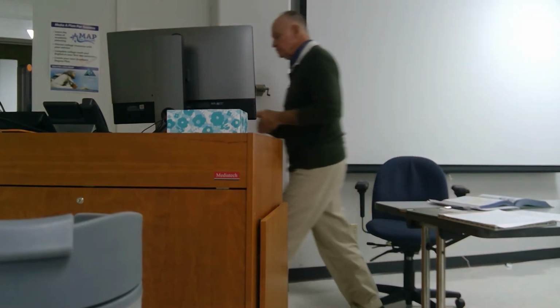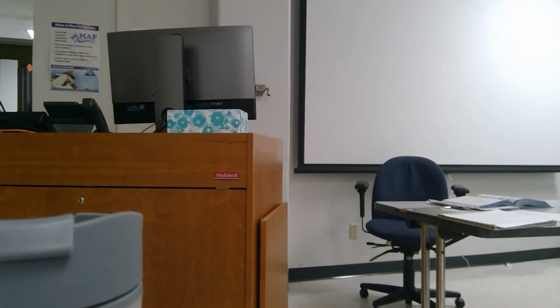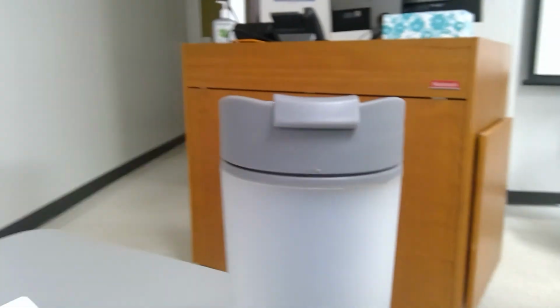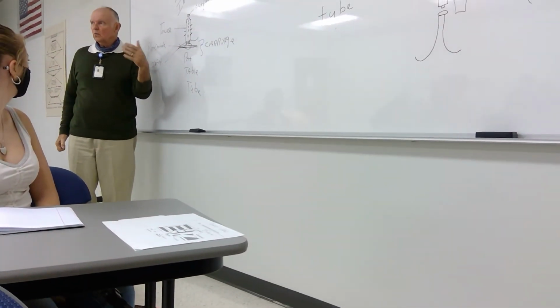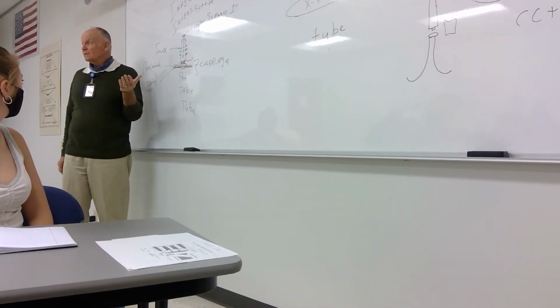All right, so when you have the patient, here's your tube, here's your patient, it's a continuous beam, your patient is producing what? Scatter. And it's continuous.